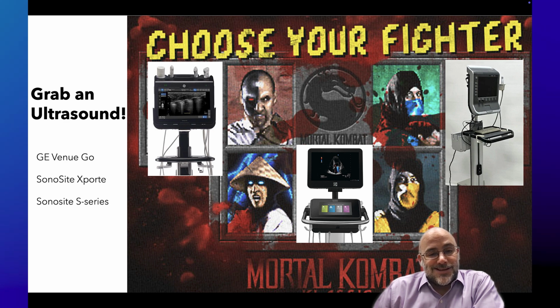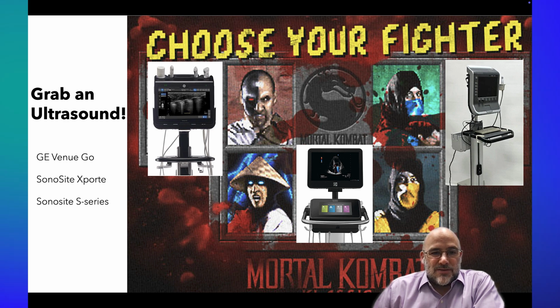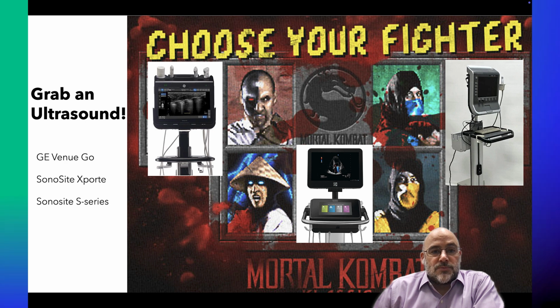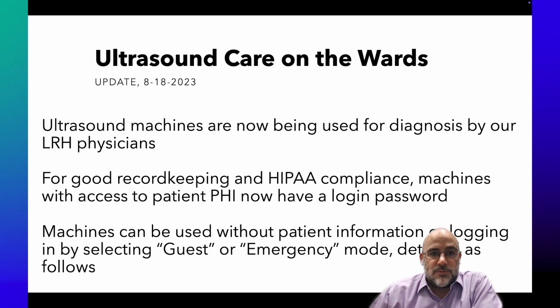So what we have here at Lakeland include the types that you see on the screen there, but any ultrasound using a linear transducer or the superficial transducer is probably your go-to. So importantly, when we're thinking about having the ultrasound available, we want to make sure that we do the things we need to take care of the equipment.